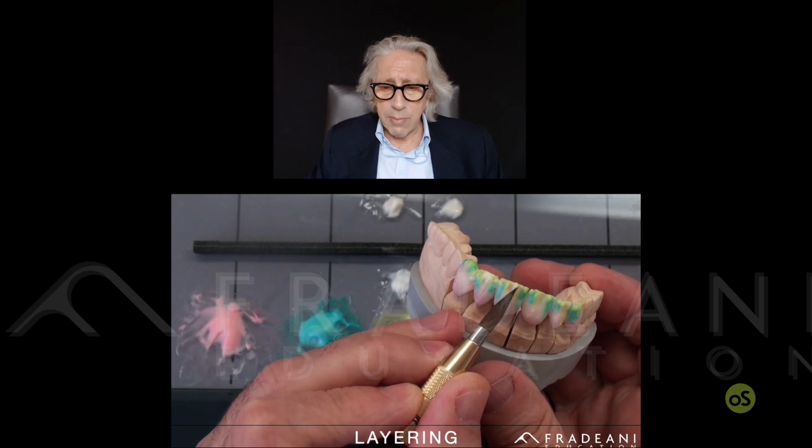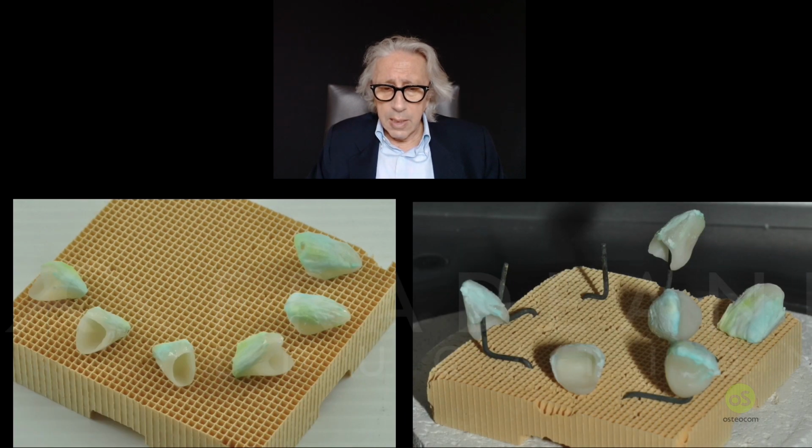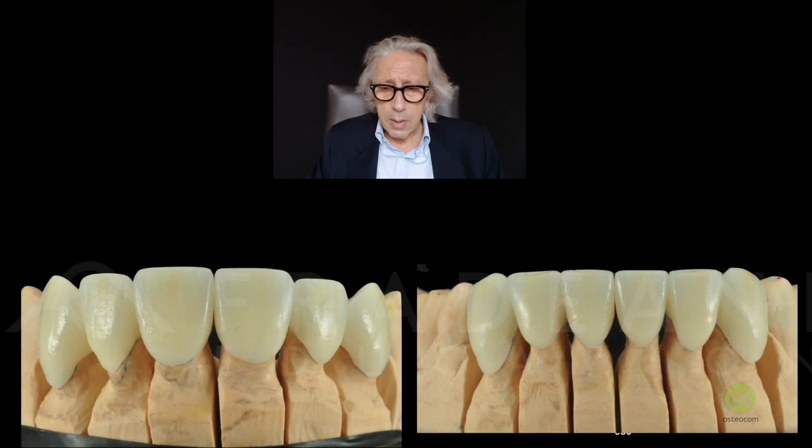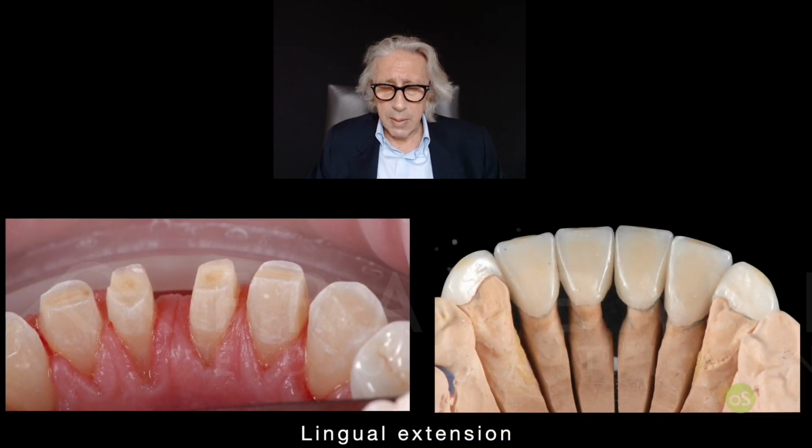And of course, that is made by Giancarlo Barducci, as I said, ready to put in the oven. Final outcome in terms of colors, upper, lingual part, buccal part. On very short teeth like that, it could be useful to create not veneers on the lowers, but a kind of full veneer.